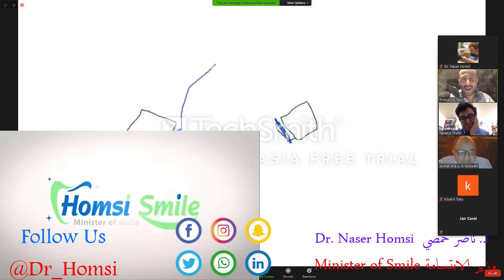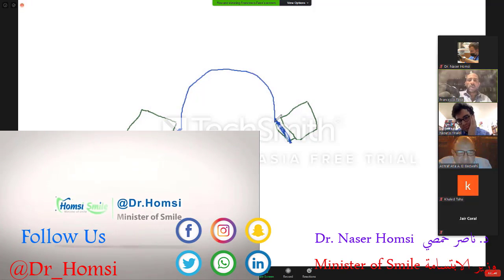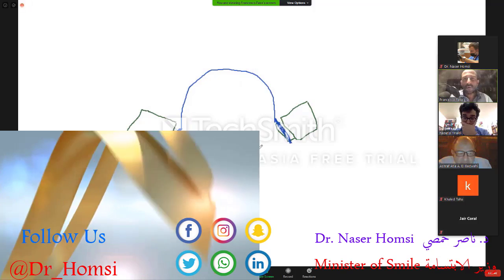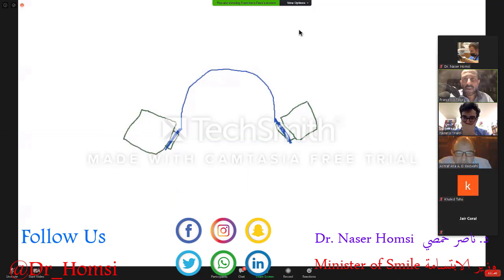So here we have our transpalatal bar, and we can adapt it perfectly passive, and then we can take it out from the patient's mouth and put it on a piece of paper, and then take a pencil and draw a little bar close to the terminal of the transpalatal bar.